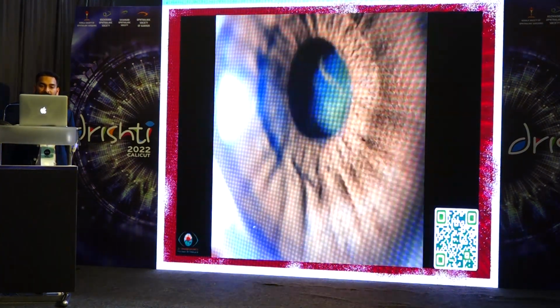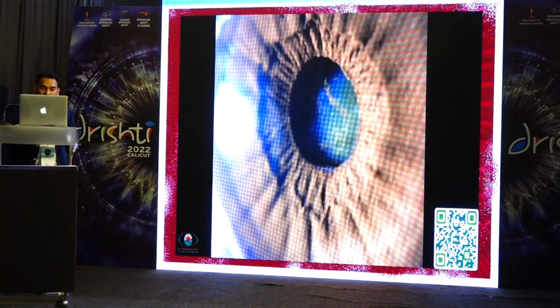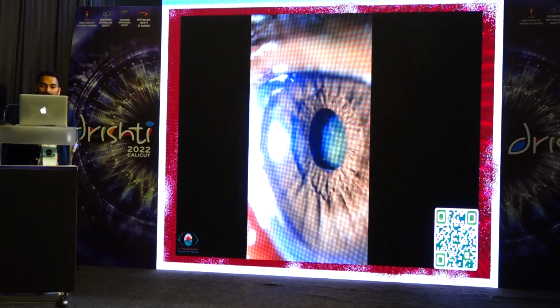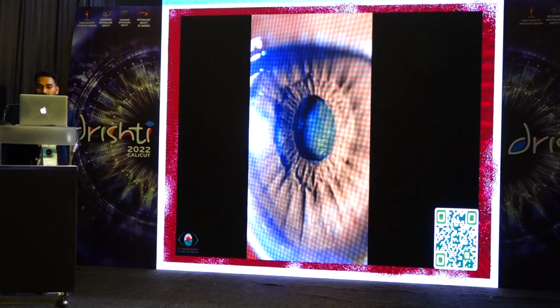Another thing is you can even take videos of these pathologies. You can see phacodonesis over here. And all of these can be taken without a slit lamp.